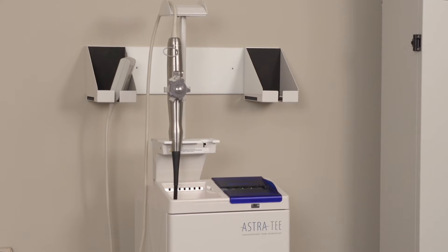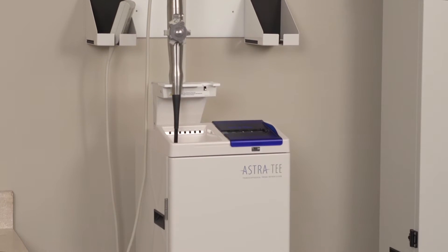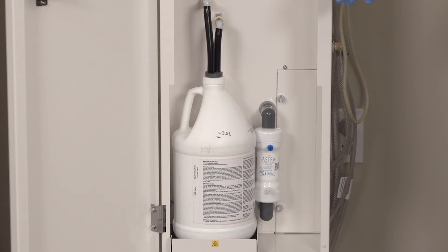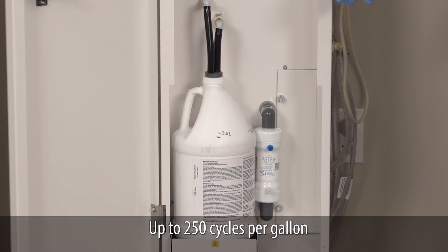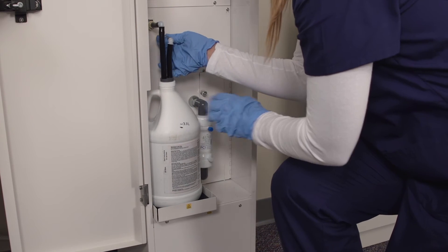The Astra does not use an expensive proprietary disinfectant. One gallon of disinfectant can perform up to 250 cycles in the Astra, even with two probes at a time. The result is significant cycle cost savings.